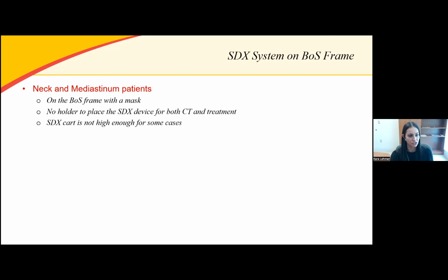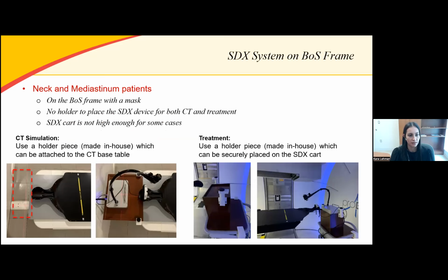The next thing I'll just mention here is that we had a few patients where physicians were requesting an immobilization device with the patient laying in a mask. So this is something that we had to have custom made for our CT simulation room, and also for our machine for treatment delivery, for tumors that are located in the upper thorax or maybe upper esophagus.